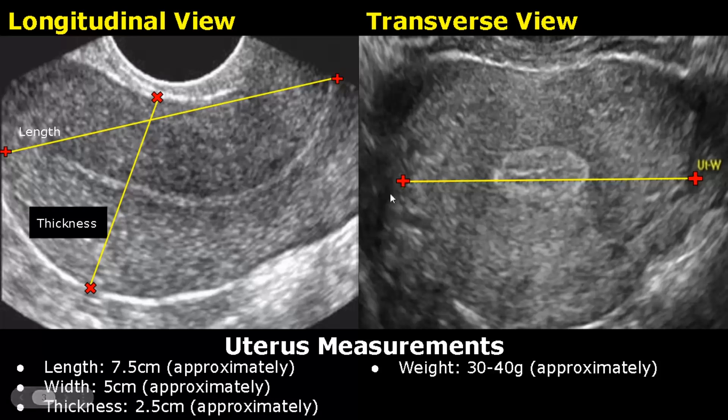And in the transverse view, taken transvaginally, we can measure the width of the uterus. The uterus weighs around 30 to 40 grams.